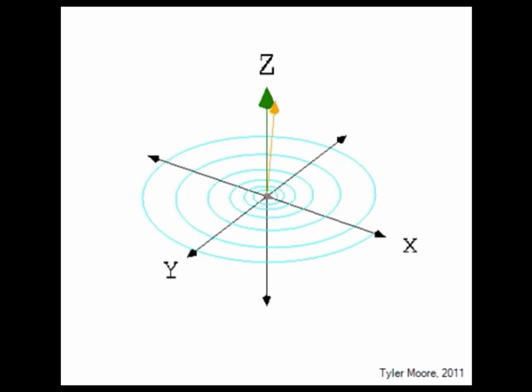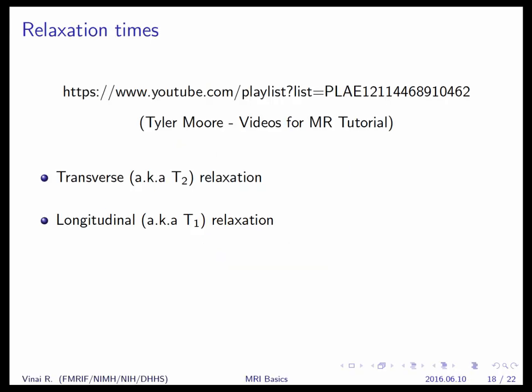Well, the oxygenation in itself affects T1 a little bit, but it's mostly negligible. In that slide I showed last time, there was work with Philborn, who basically showed T2 change, but he tried to measure if it changed T1, and it didn't. So magnetic susceptibility effects don't really affect T1.